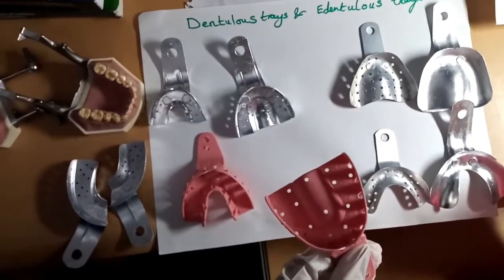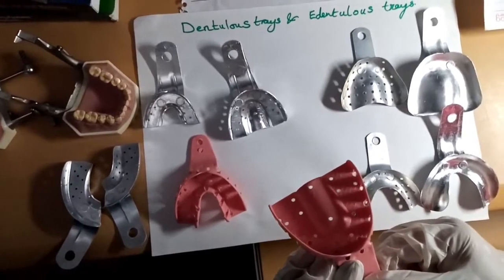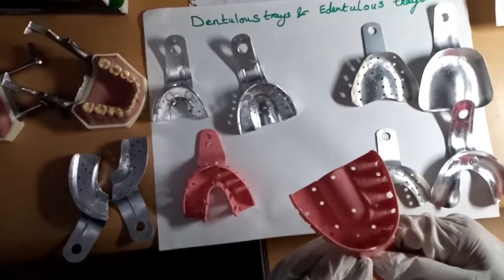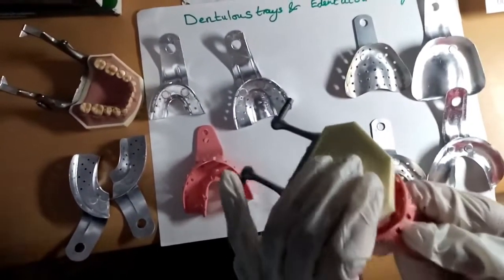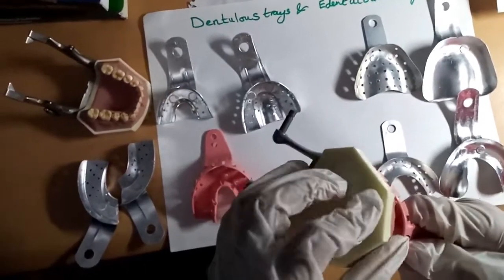Okay, we have the handle, which holds the tray in the patient's mouth. The main use of the handle is to hold the tray in the patient's mouth like this, okay? So here we record the teeth, and the handle is used to hold the tray in the patient's mouth. This is the handle.